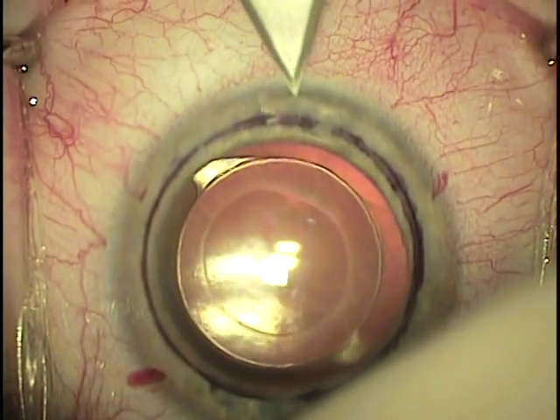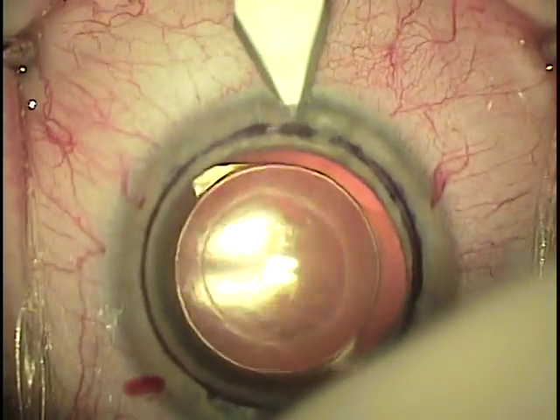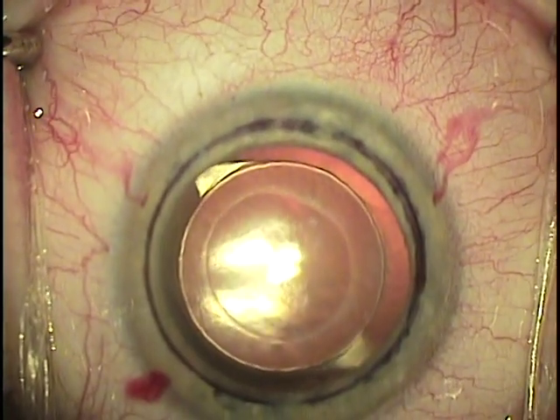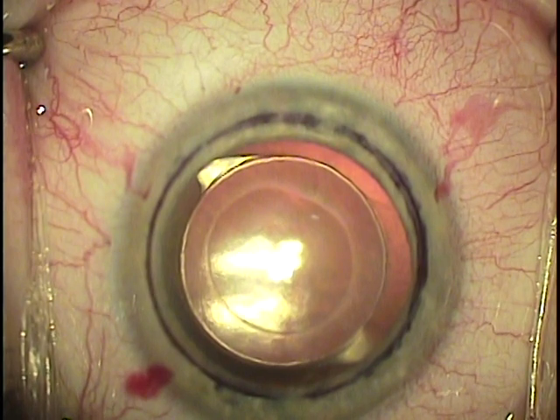I am presently using a clear corneal incision and I do this with a 3.2mm keratome. This is beveled in the usual fashion as you would for a clear corneal phaco.